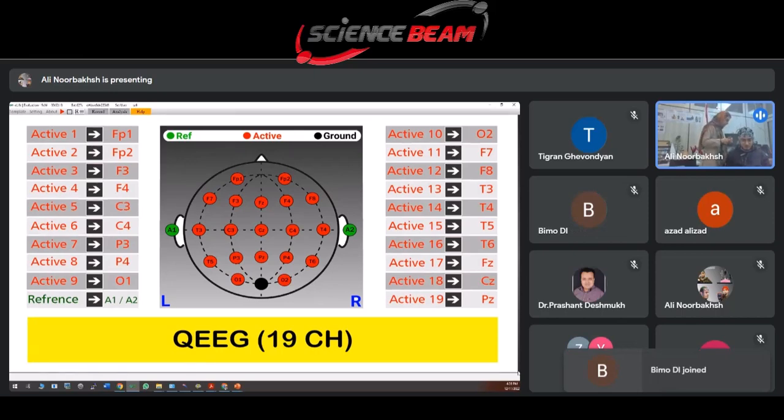There are two references for this cap. And it has a green color. This is a reference, okay? The green.